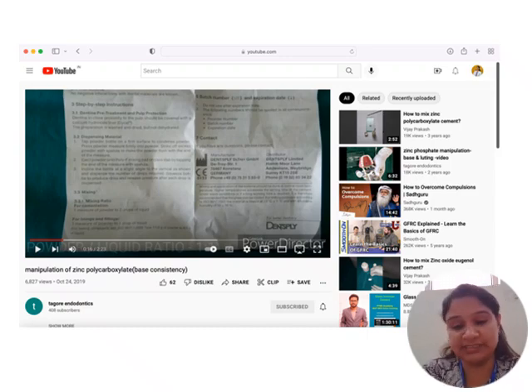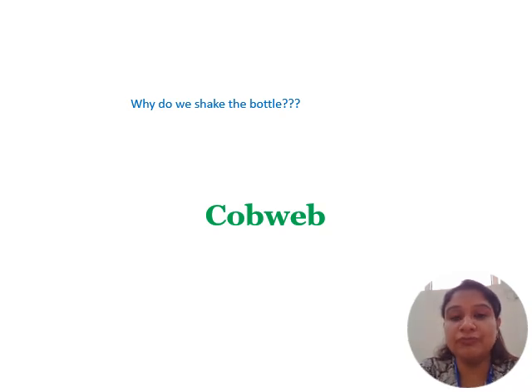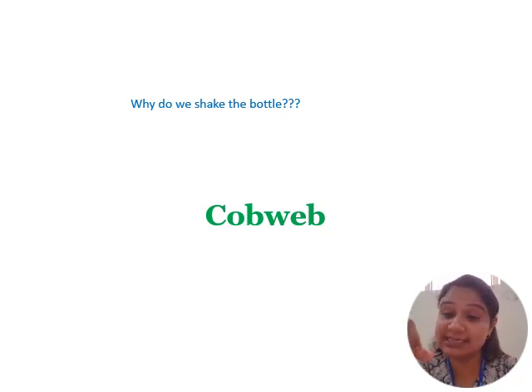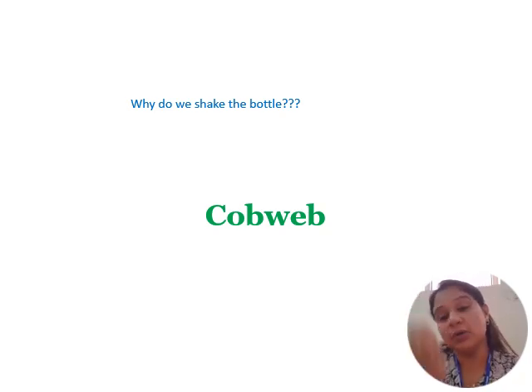Before dispensing the powder and the liquid, we have to shake the bottle well. Even for the powder, we have to shake it nicely and then tap it on the top so that the powder settles down, and then scoop out the powder. Also, the liquid has to be shaken and then dispensed at a 90-degree angle so that it has one single drop and there is no air entrapment.